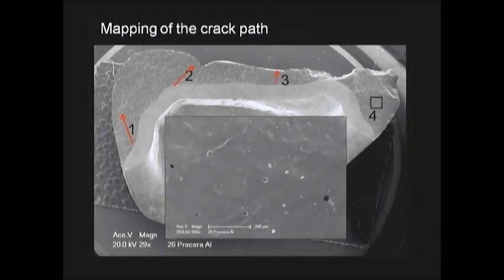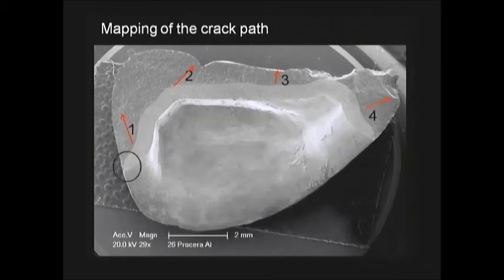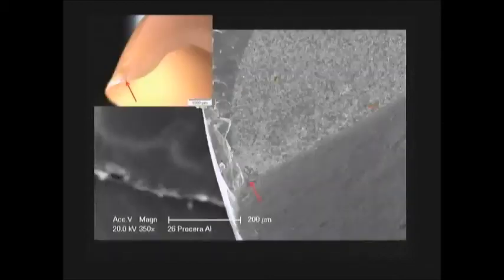Number 4, to the right. The veneering ceramic of an all-ceramic restoration is great because it's lots of glass, so it's very easy to see. So, okay, something becomes suspicious because it must have started somewhere here. So then we focus on the margin. What do we see there?